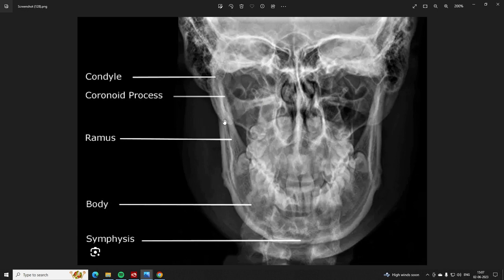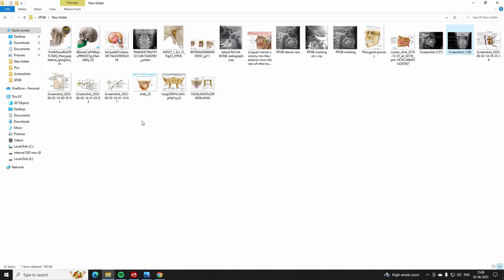Even if you see your needle going a little upwards, it is a bent needle, so you can direct it such that the needle comes medial, not too much superior, and anterior. These are the directions by which you ultimately reach the lateral border of the nose, and then your stimulation will be started. I think this will help you with all these pictures.